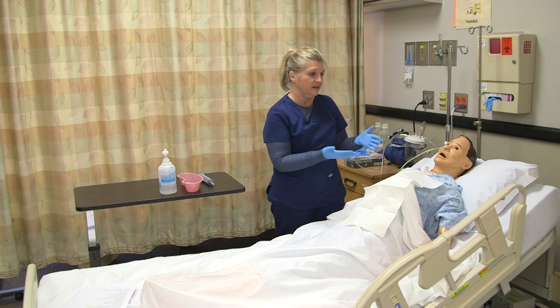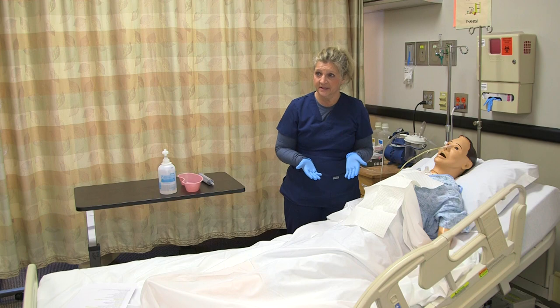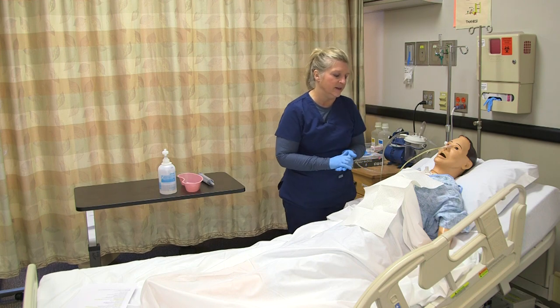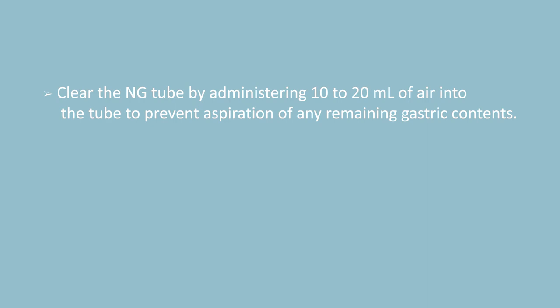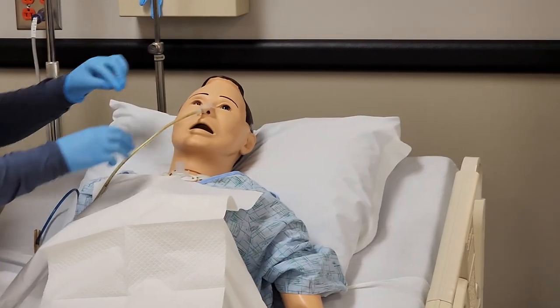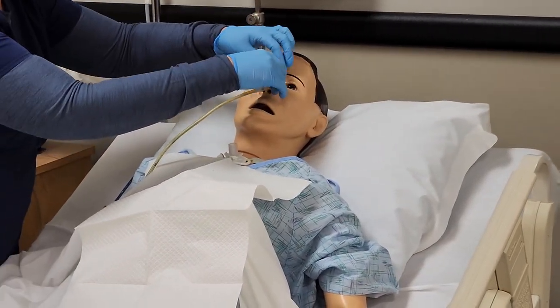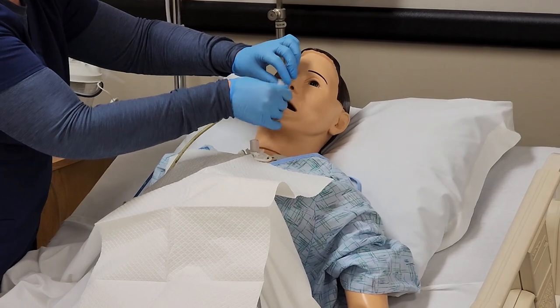I'm going to have the patient's head of bed elevated at least 30 degrees, because that will facilitate removal. Make sure that they can tolerate that. Then I'm going to go ahead and remove the securement device or the tape.